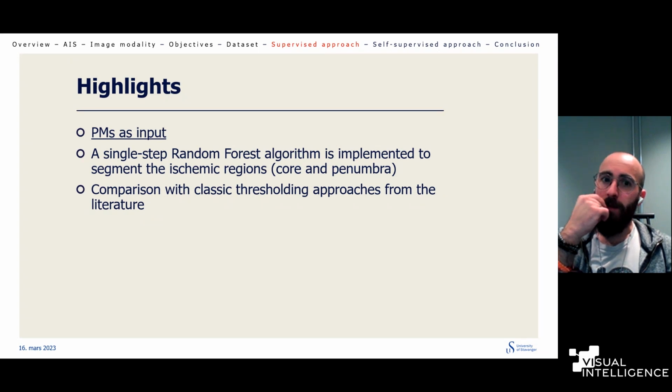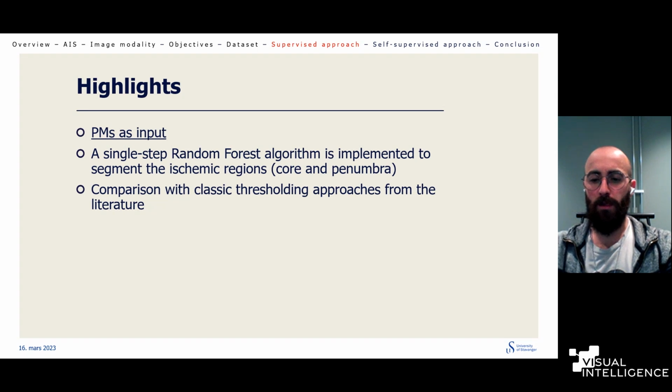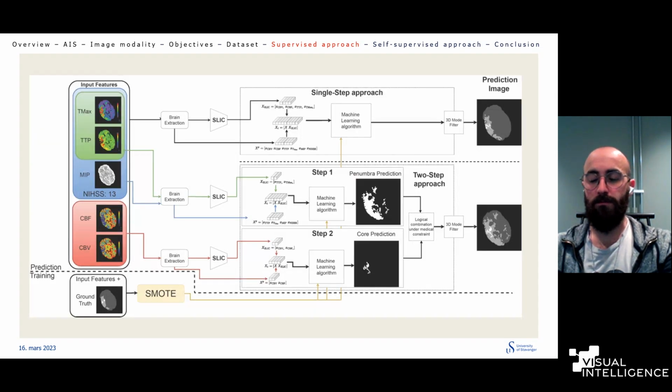And we tried to compare this classical machine learning algorithm to the thresholding approach from the literature, which is something that normal research has been doing for decades.